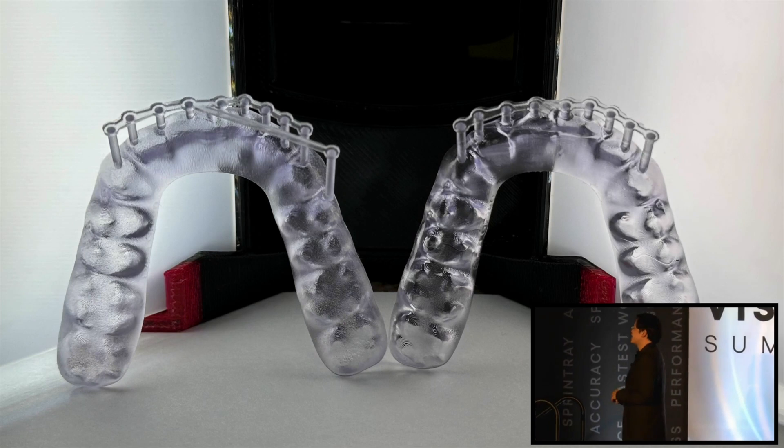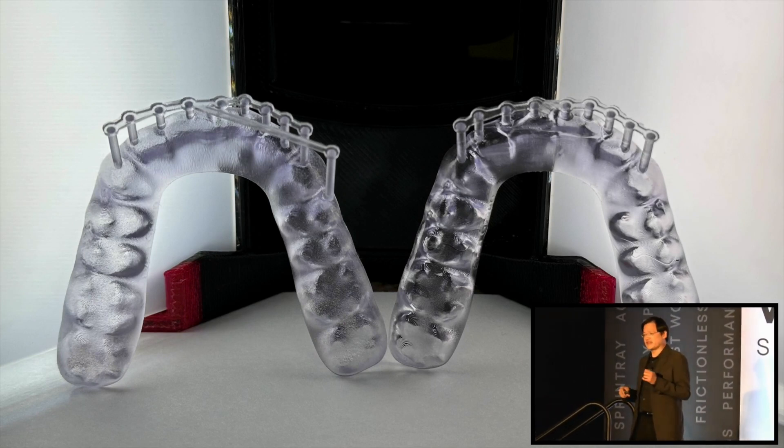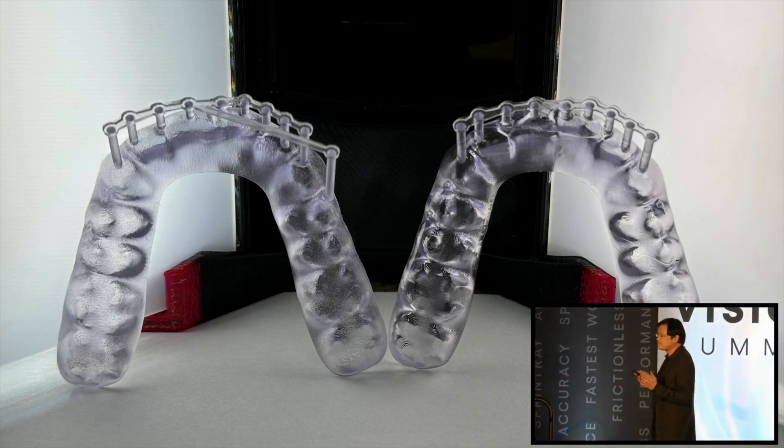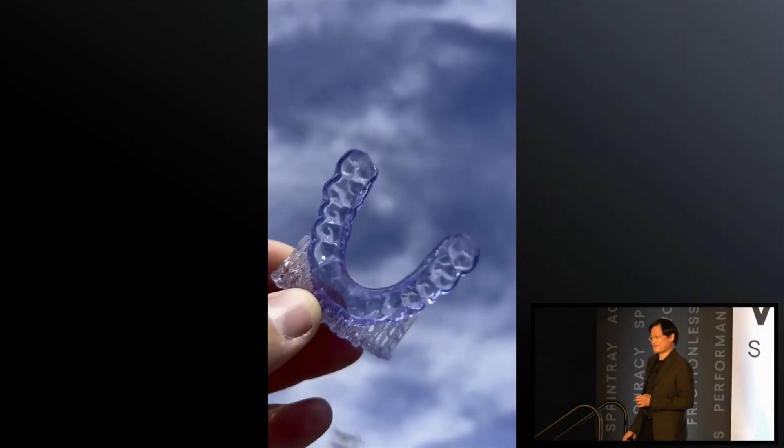In these particular cases, all I did was take a little SprintRay snipper, snip off all those supports carefully, and I'm delivering it in the patient's mouth. It's really as simple as that. There's an additional 5 to 10 minutes saving in clinical efficiency. And here's the midnight purple — my favorite color.